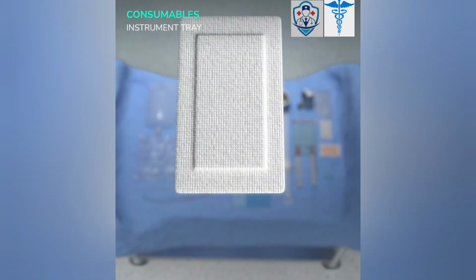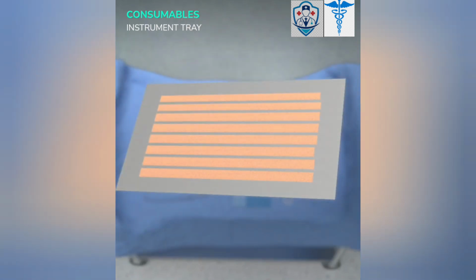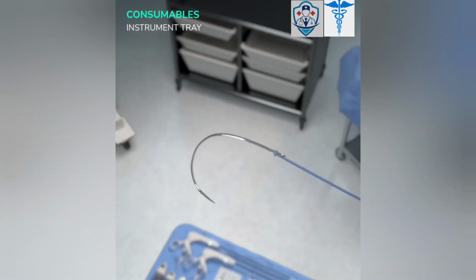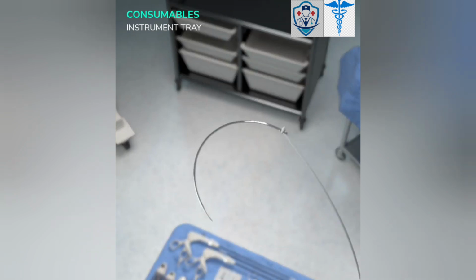Wound dressings can be used to cover the trocar sites at the end of the procedure. Steri-strips are sterilized surgical tape, which can be used for wound closure. Size 1 absorbable braided sutures with J needles are used as stay sutures for the Hassan port. The size 4 to 0 monofilament.